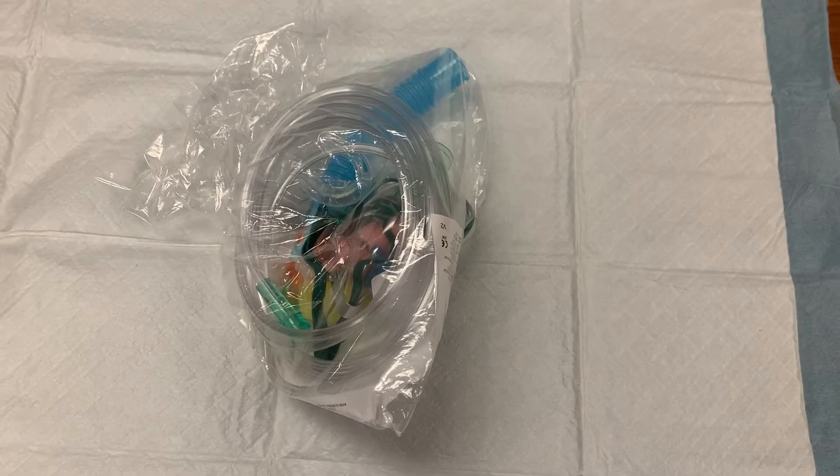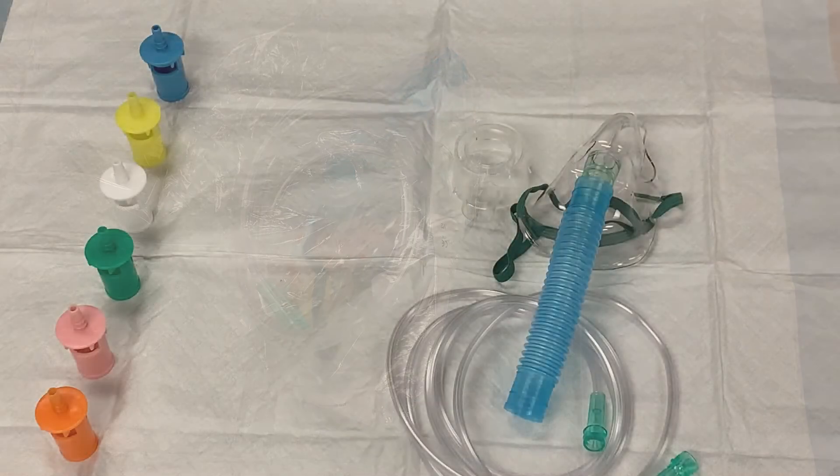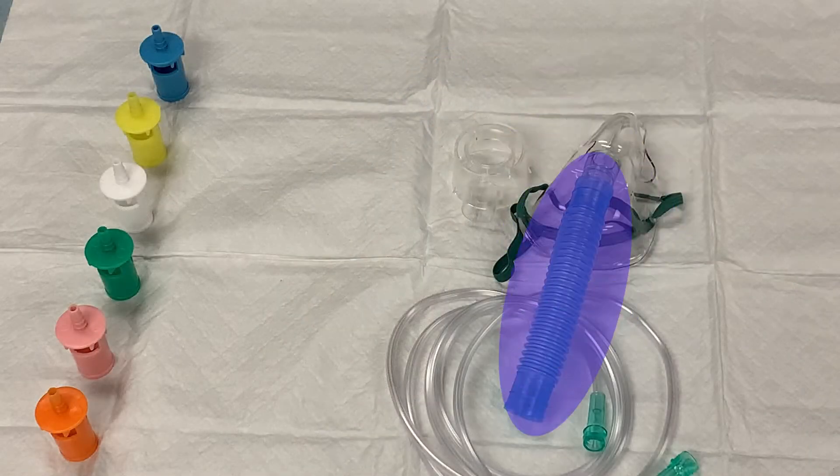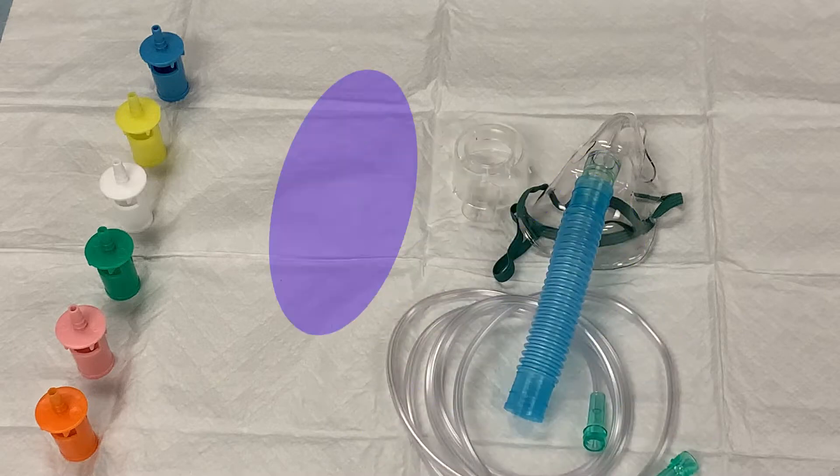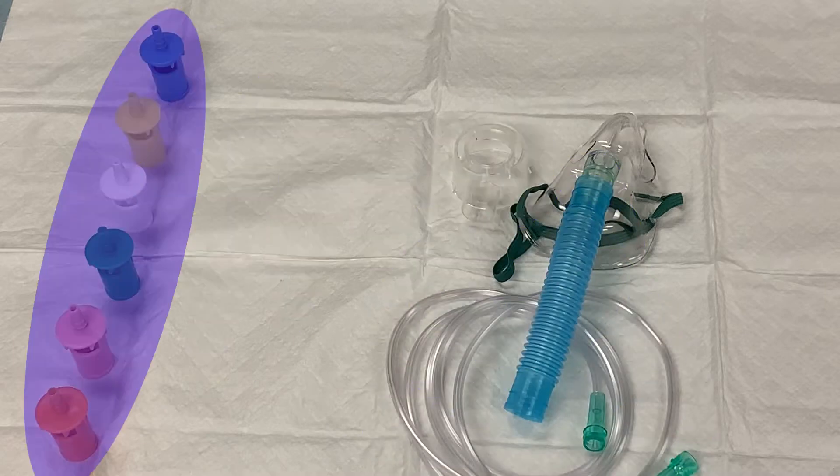The venti mask kit is packaged in a plastic bag and will look like this. Inside is a mask attached to blue tubing, a length of oxygen tubing, a plastic guard, and a set of oxygen delivery adapters. Each adapter will deliver a different percentage of oxygen to the patient and requires a different amount of oxygen flow to properly function.